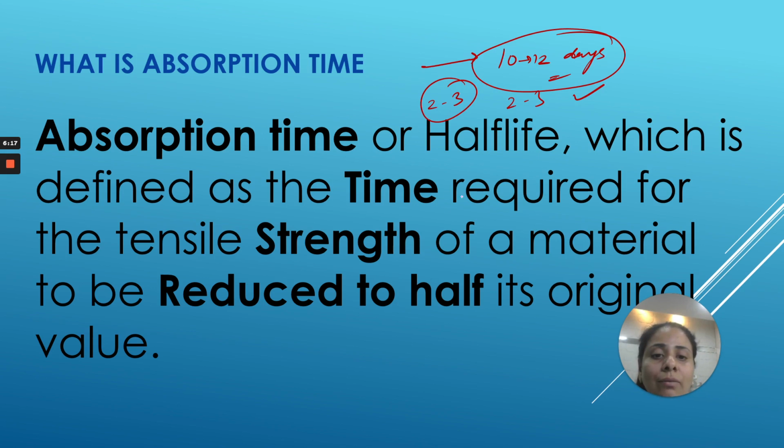I want a suture material which has a half-life of at least 8 to 10 days, so that by the time I remove my sutures, they still have some tensile strength left. So the choice of the absorbable suture material will also depend upon this factor.